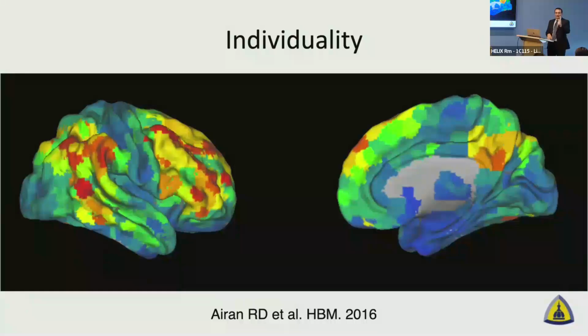So I'm not saying, these are the first ones, find the ones from the second set that match the best. What I'm saying is these are 60 studies, find the ones that pair together, right? And that's conceptually very, very different. And the algorithm was actually able to do this with 97% accuracy, which means 2 things. Number one, that reproducibility is high per individual, but also that each individual's pattern is unique enough that it doesn't get mixed in with other people's, right?